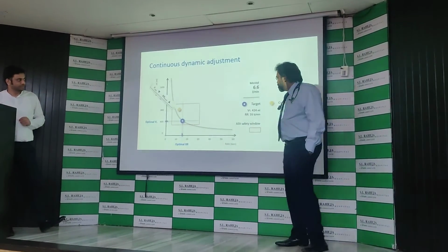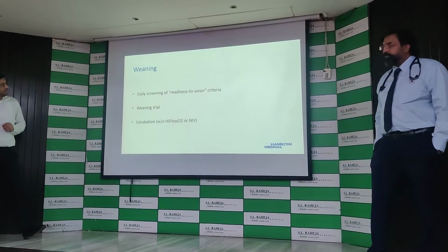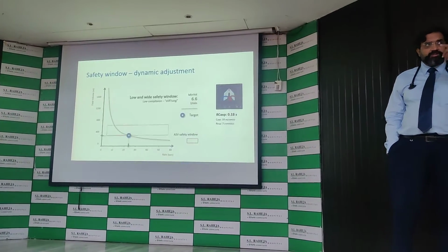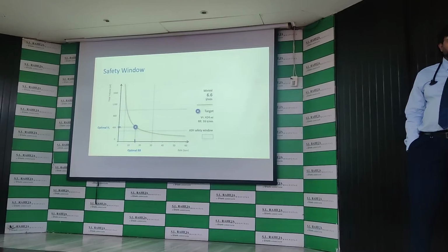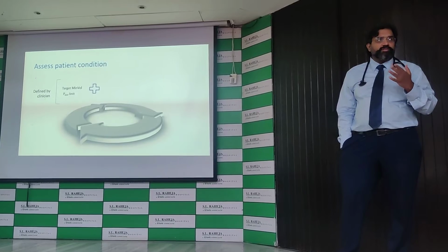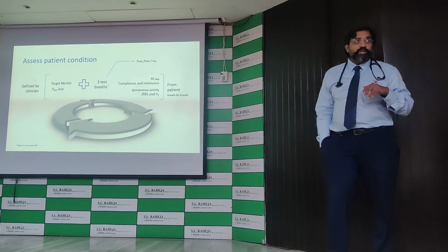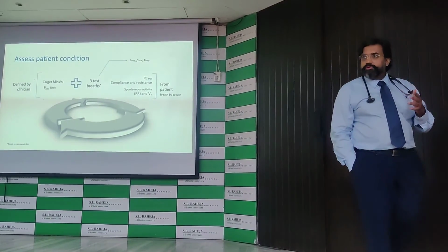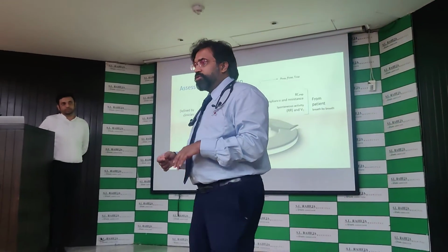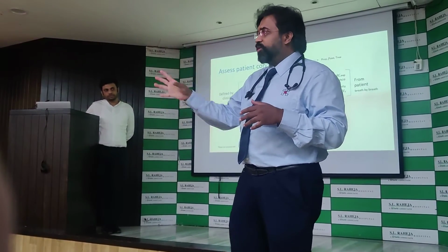But for that evaluation also, it will try to do a test breath again, and then it will check. Probably it will do it every time it goes out. One of the problems of this is that it gives high RRs, and the I:E ratio is completely dependent on the time constant. So that makes it a little bit difficult, because very often you get 1:1 breaths on ASV, which is kind of an inverse ratio. Very often you get punished by the time, because the time constant of every area is different. If next time you look at ASV, you get punished on almost all events.